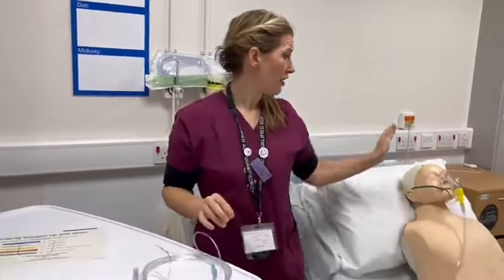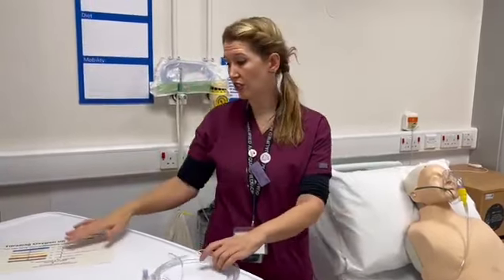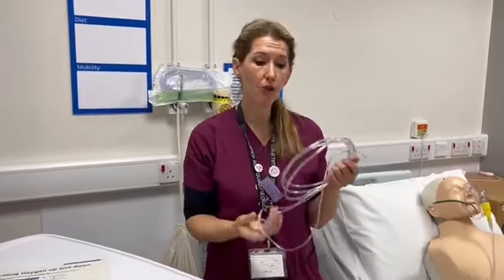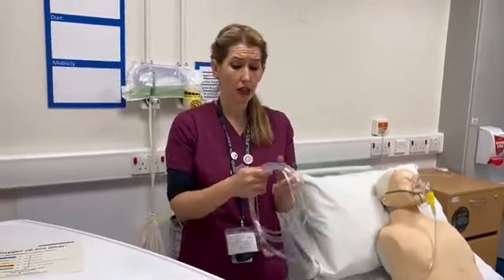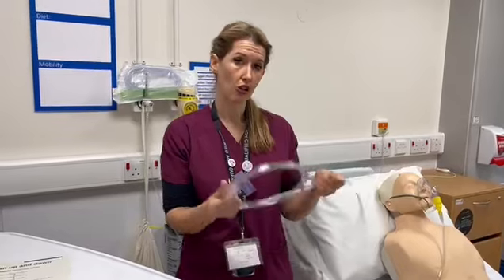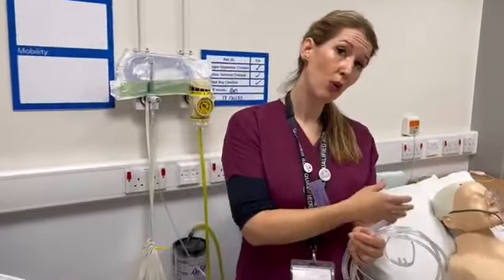So for our 35%, they've currently got 8 litres coming through the oxygen flow meter. Now, according to our chart, if we want to convert them to nasal cannula, we want to put them on 4 litres. Now, we don't want to leave our patient without oxygen because they are hypoxic and need this amount to support them. So I would make sure that I have everything available to us when we're starting to make that change. So make sure you get hold of your nasal cannula, open it from your packet, and I am going to explain to my patient what we're going to do.